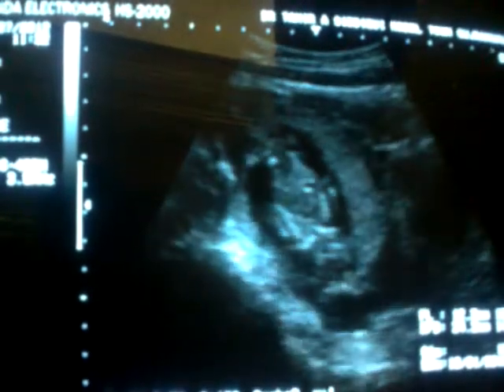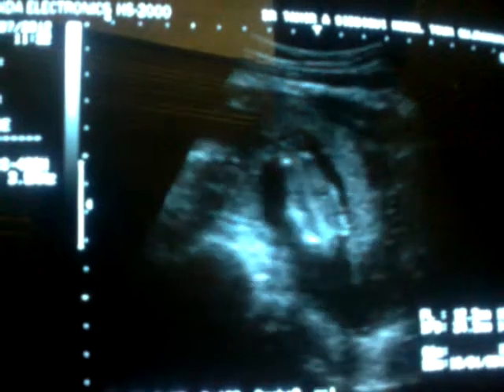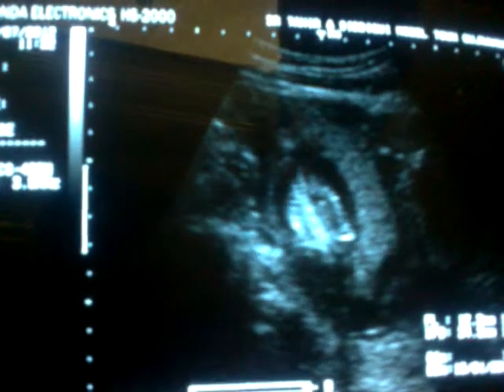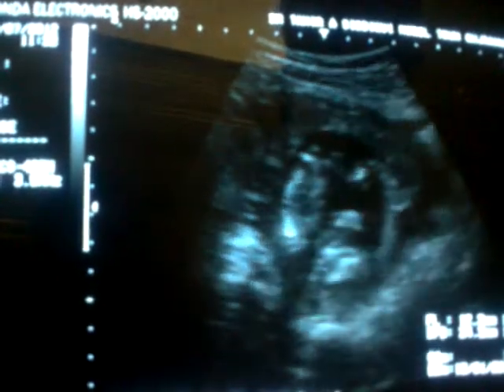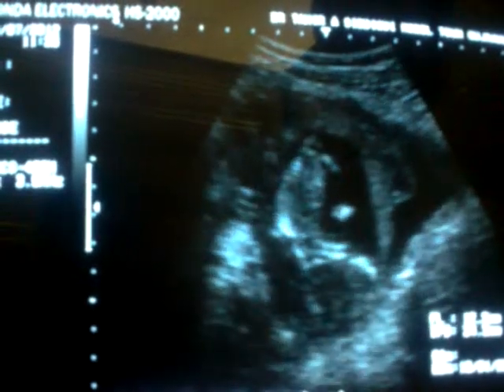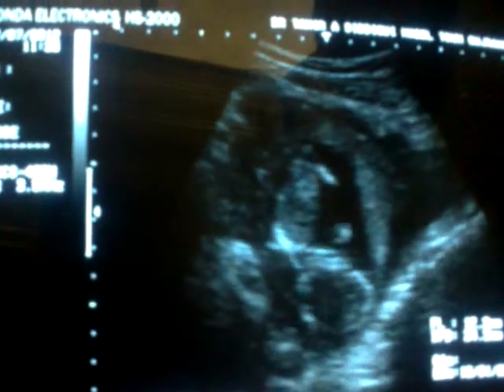This fetus is normal anyway. This is the vertebral column. Now you see this central. So we don't see any gross anomaly in this fetus. This fetus is normal.